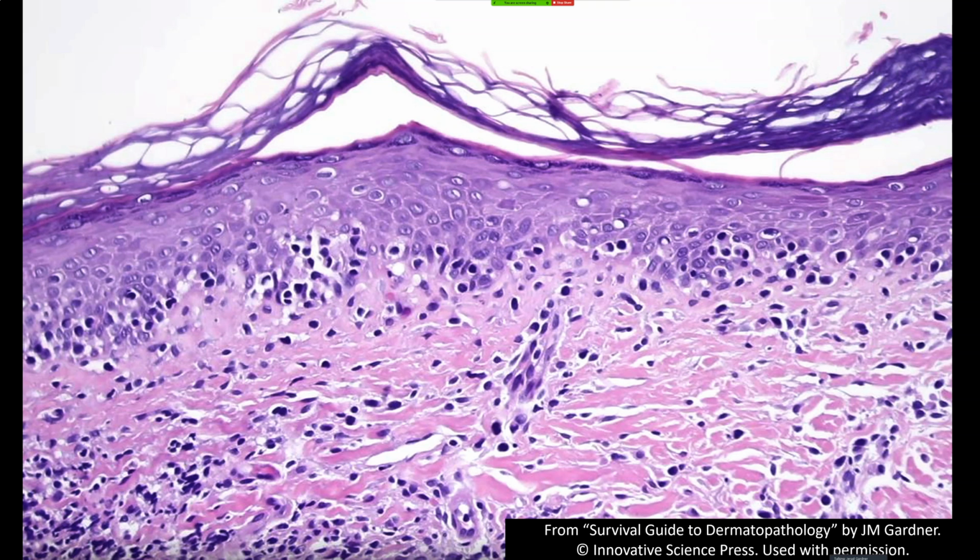But what I go on more personally is the architecture usually. And then you combine that, of course, very importantly with the clinical. So I'm not really going to show clinical in this lecture, but that is so crucial, making sure that if I think something looks like mycosis fungoides, it really has to fit and make sense clinically and fit with the history and the appearance. And so that's why it's often really difficult to make a definitive diagnosis of mycosis fungoides if you don't have a complete story, especially with the dermatologist's impression and the clinical information.